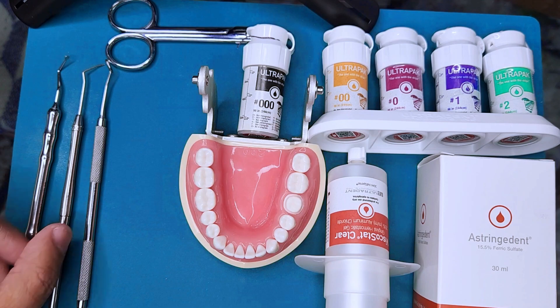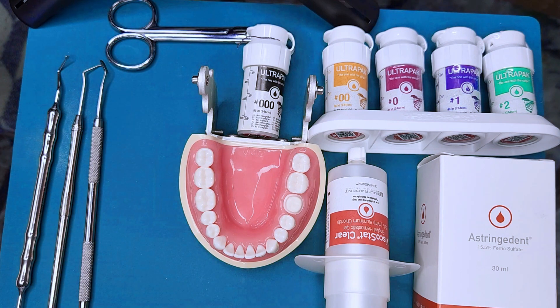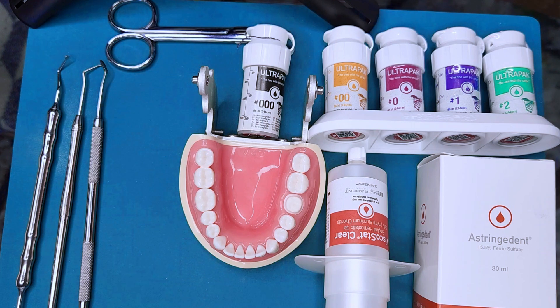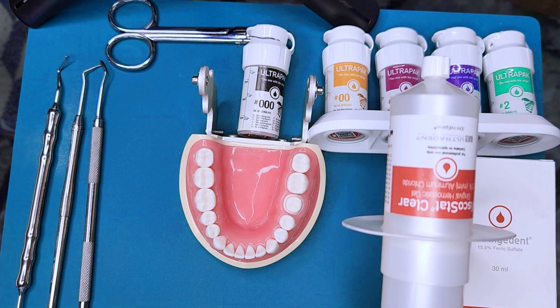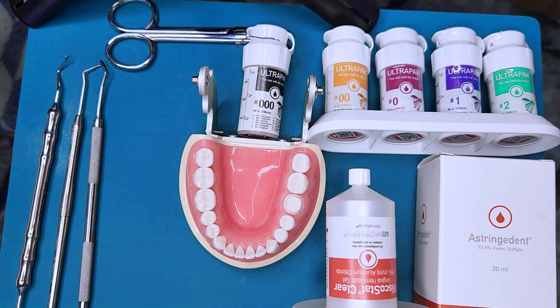You should also have a straight probe, a cement spatula or plastic instrument to hold the cord in places where it keeps coming out, and a scissor. I use aluminium chloride from Ultradent, which is called Viscostat — it's a great product. Try to look for aluminium chloride rather than any other astringent when doing cord packing.